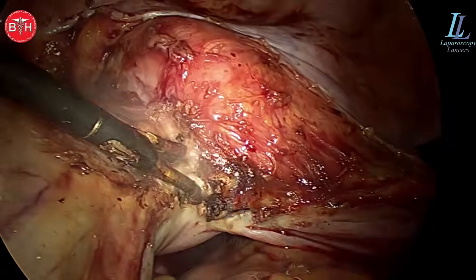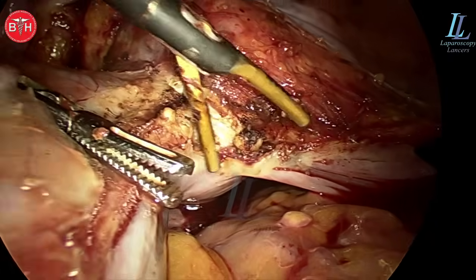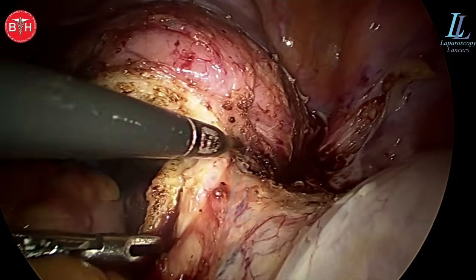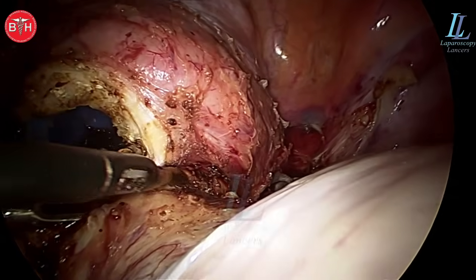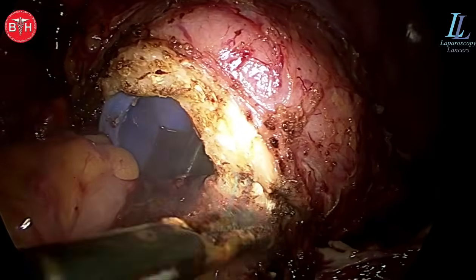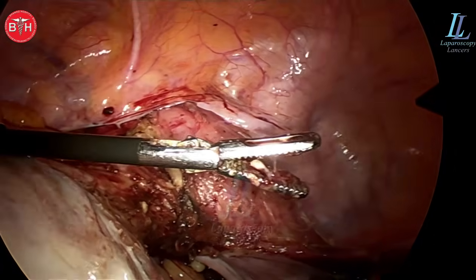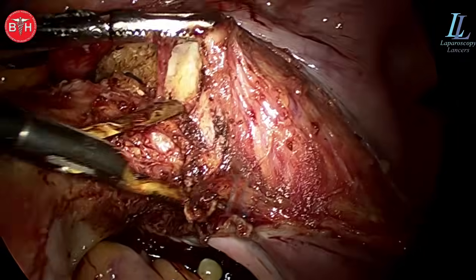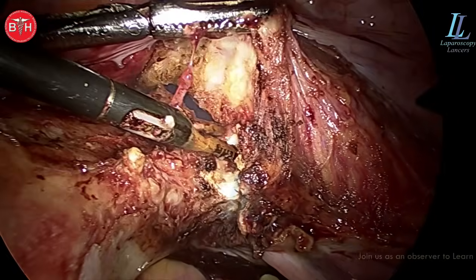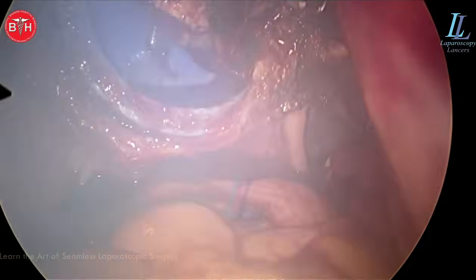The field should remain white. Now the uterus will turn white as both uterines are taken. I am dissecting in the anterior fornix — the Marwa's manipulator cup is holding it. There you can see the uterus is as white as a rabbit. Now colpotomy has been done. I prefer to use bipolar shearer only in cutting mode — bipolar shearer in cutting mode to take down the colpotomy. Do not use a monopolar device here as it causes lots of smoke, very high temperature, and chances of VVF formation are very high, especially when the vaginal wall is very thick in cases of PID.